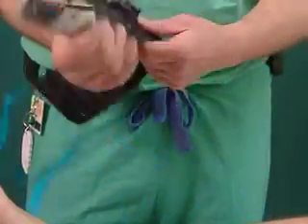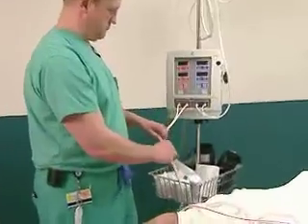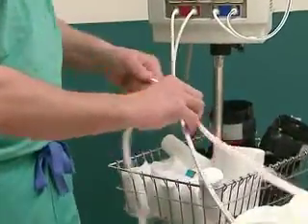Before applying the cuff to the patient, inspect it for rips or holes and be sure that the tubing connecting the cuff to the system isn't kinked or occluded.